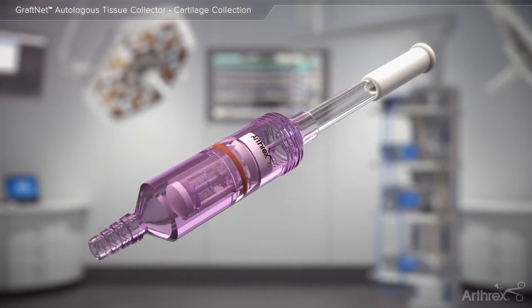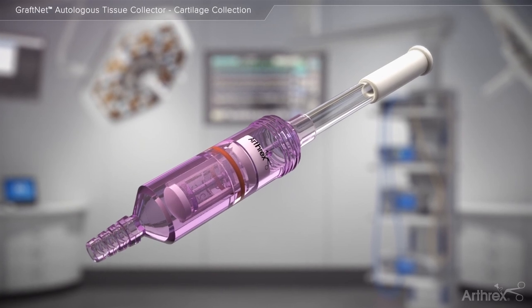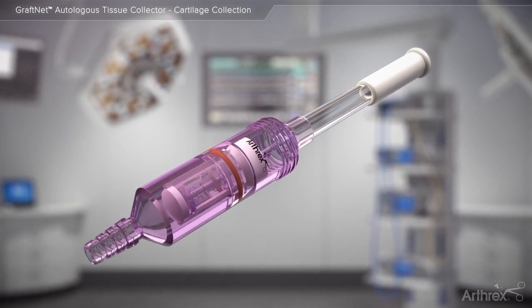The GrafNet autologous tissue collector makes gaining access to autologous tissue as simple as resect and collect.